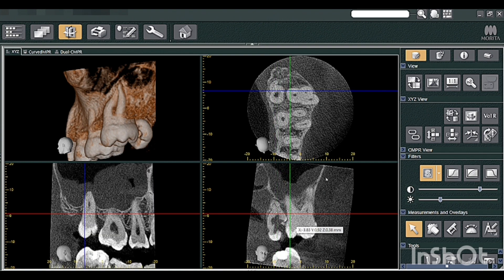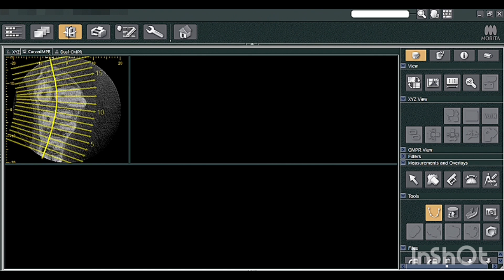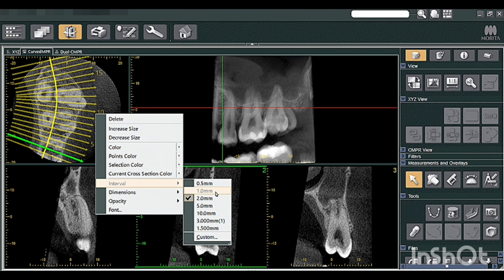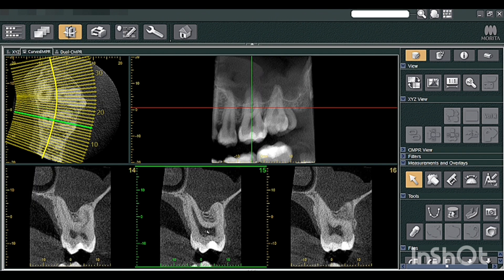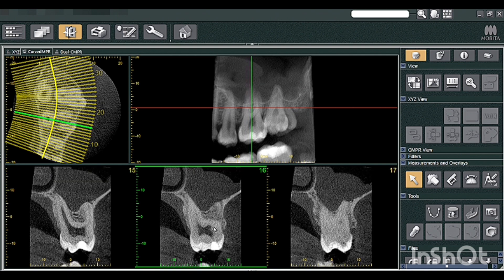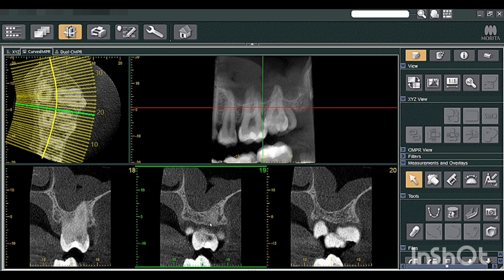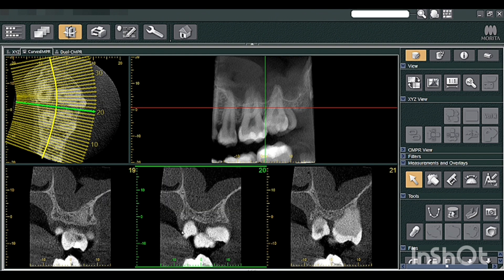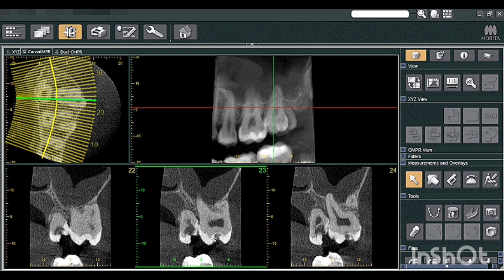If you want a detailed view, you can mark the spline markings and study it using interval lines. There are 1 mm interval lines. This is the distal aspect of 26 — the meso-buccal root, palatal root, and disto-buccal root of 26. Coming to 27, you can make out proximal caries evident in the 26 distal aspect. Moving one more mm ahead, you can see the interdental region, and this is tooth 28 which is palatally placed next to 27.